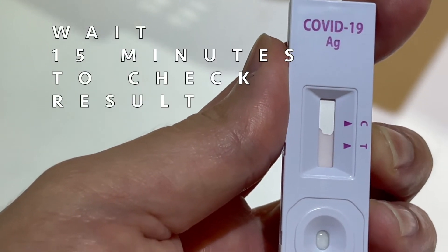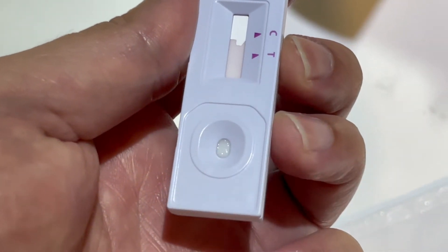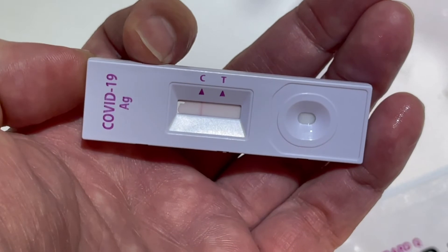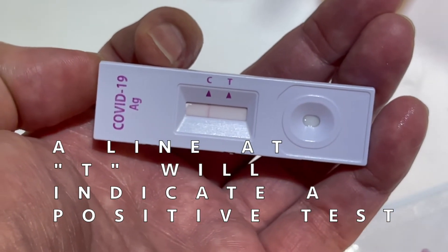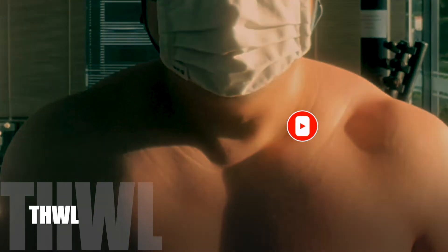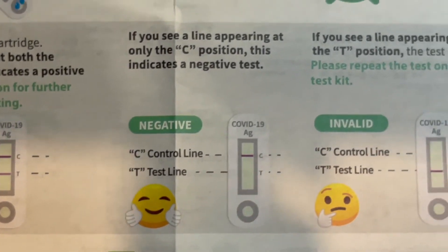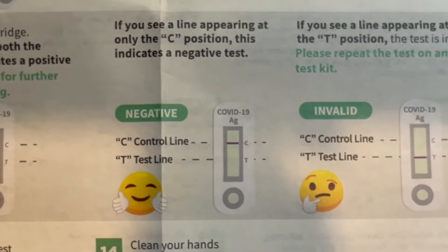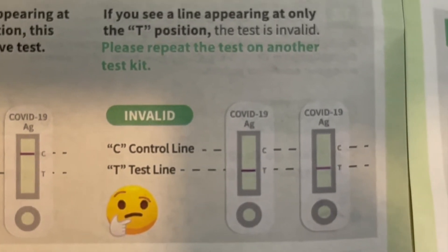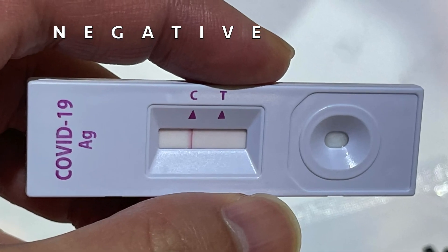Wait 15 minutes to check result. The line at C indicates a valid test. A line at T will indicate a positive test. If your test is positive, please seek medical attention for further evaluation. If your test is negative, all is well. Your test is invalid if you do not see a line at C, even if you see a line at T. Congratulations if your test result is negative.